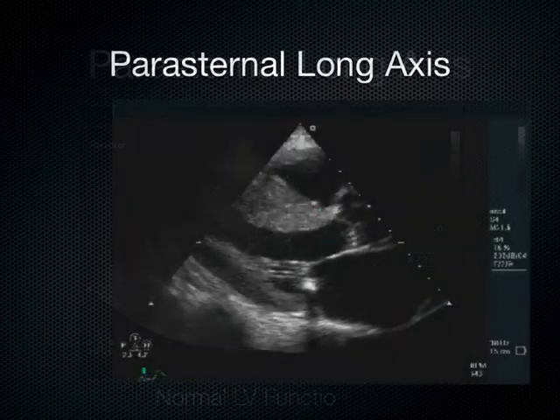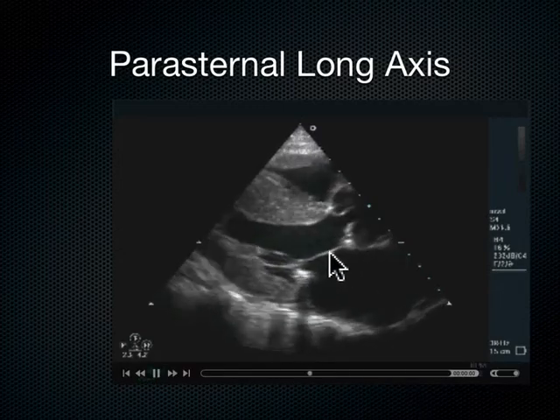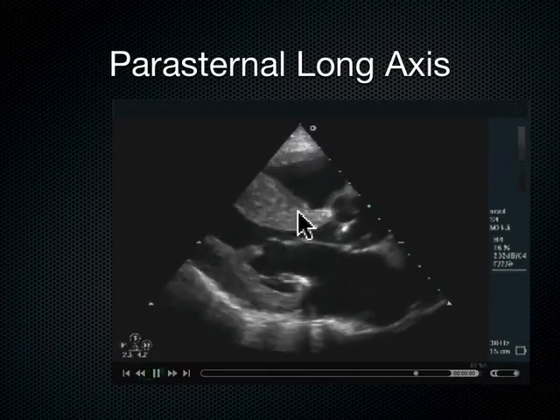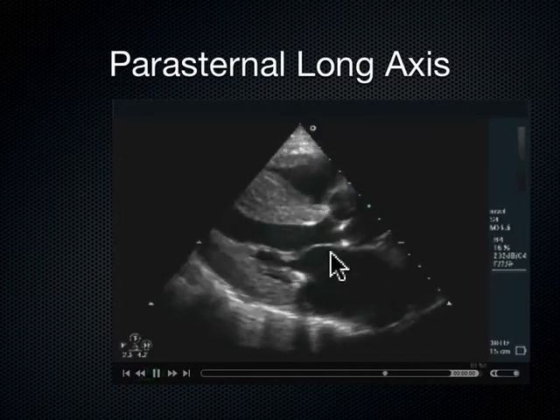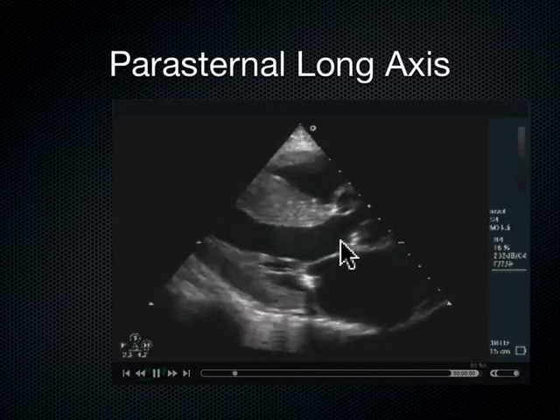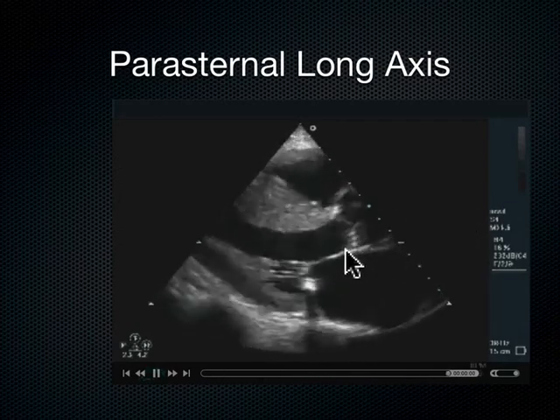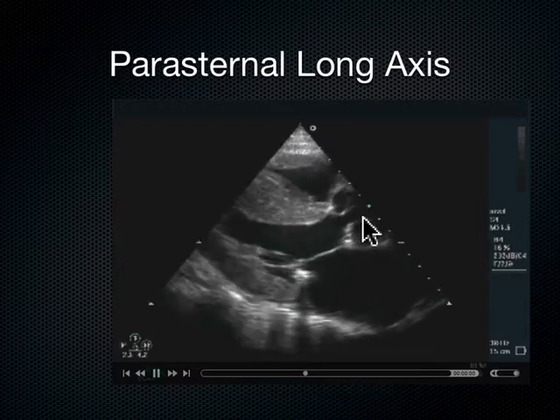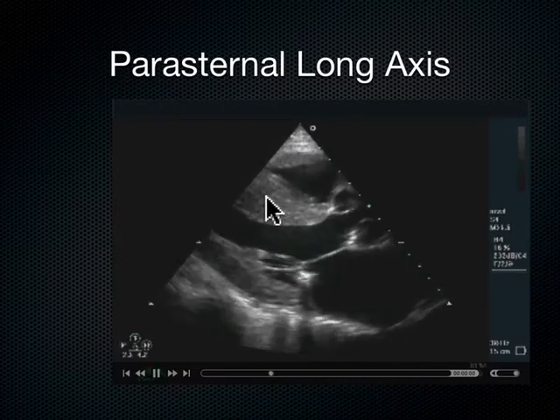Now let's look at another heart and do the same thing. How's that septal leaflet doing? Is it coming up and smacking the interventricular septum? You know what? It gets very close. It's got some good movement. I'm going to say yes. Okay? Is there sequentiality? I don't think so. They seem to both kind of fire at the same time. So I don't see one then the other. Then I've got to move on here.